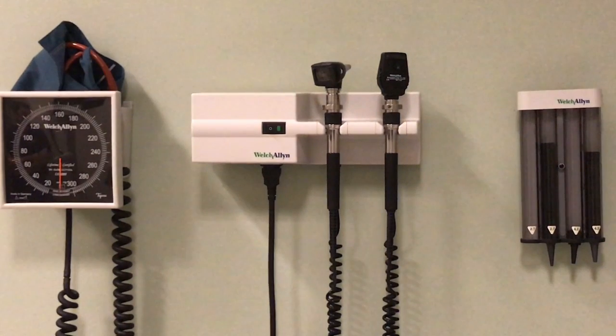Welcome to the Doctoring 1 HEENT cluster exam. The HEENT exam differs from the previously learned cluster exams because it is a body area exam incorporating elements of multiple organ systems and requires special tools, the otoscope and ophthalmoscope, as part of the exam.